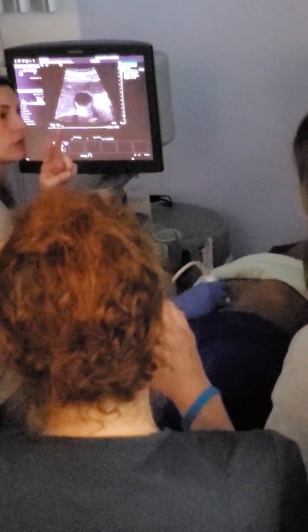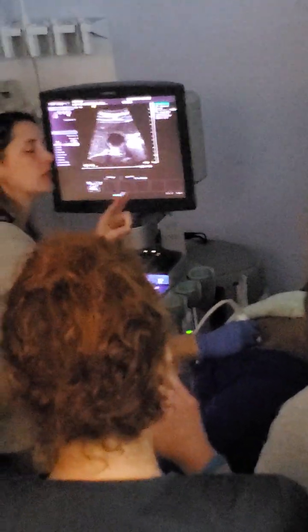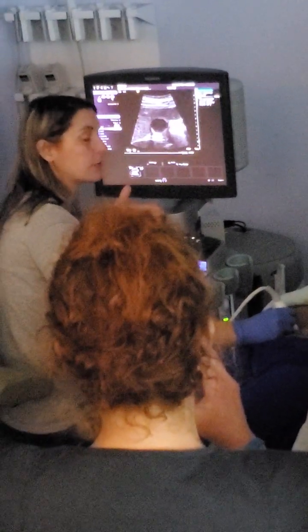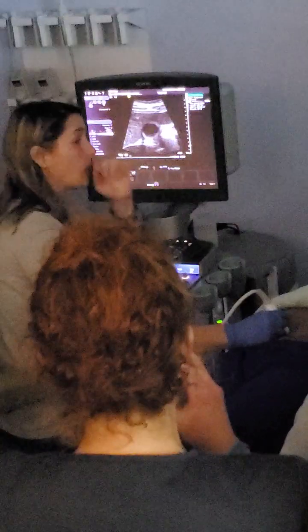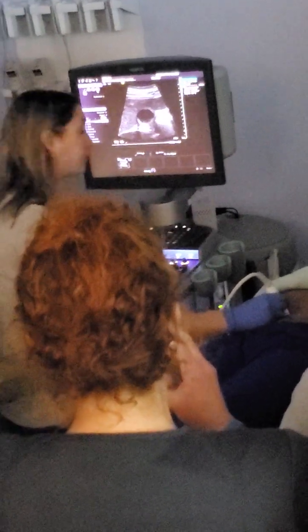How many fingers? So 2 in sag, then the wall measurement, so 3. You can measure one of your sags with the wall measurement. So 2 images, 1 with calipers, so 3 in sag. And then neck, body, fundus, and transverse. And then when you roll, you don't need quite as many. You're just going to need 2 representatives in transverse and 1 in sag. Go ahead and breathe from that if you're not.